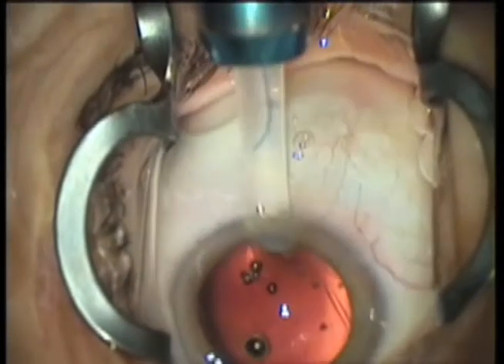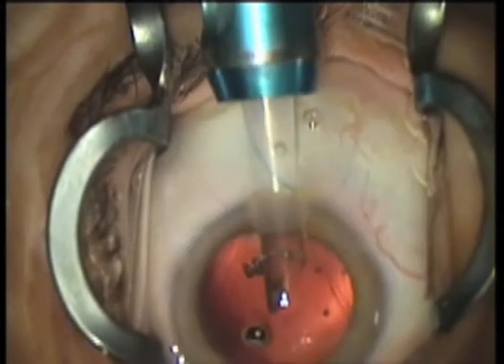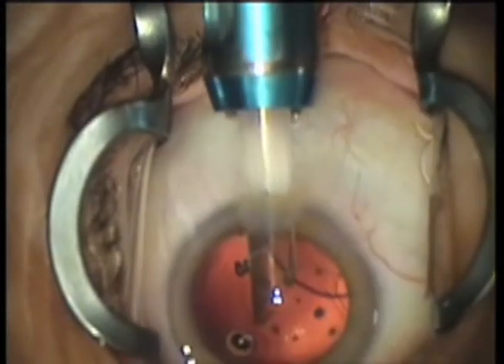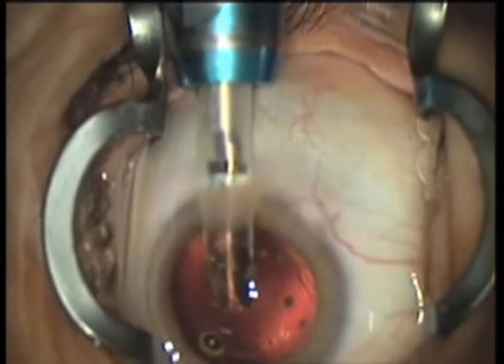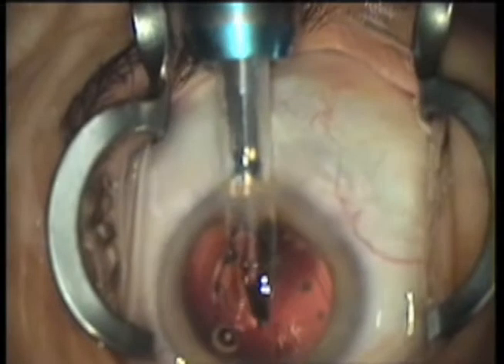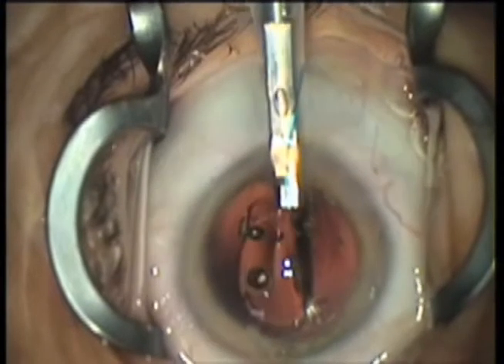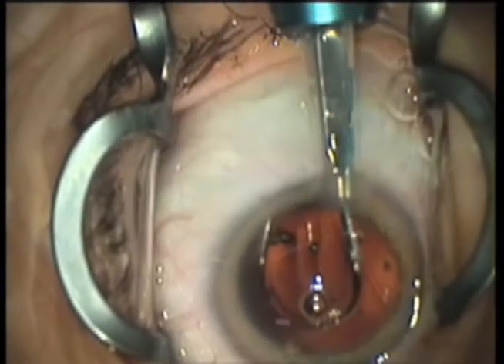After filling up the entire chamber with OVD, in most cases there is adequate capsular support to implant an IOL into the ciliary sulcus. The overall diameter of the chosen IOL should be 13 mm. If the IOL is to be seated in the sulcus, adjust the IOL power for the changed lens position. A rule of thumb is to reduce the lens power by 0.5 diopter from the power calculated for bag implantation.